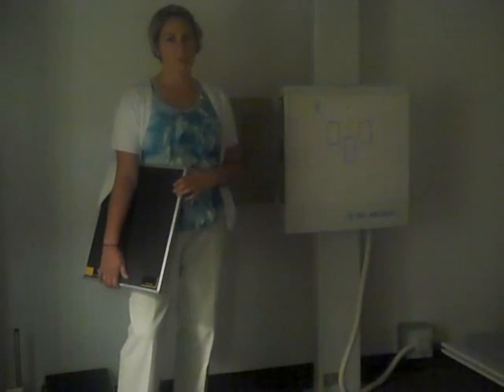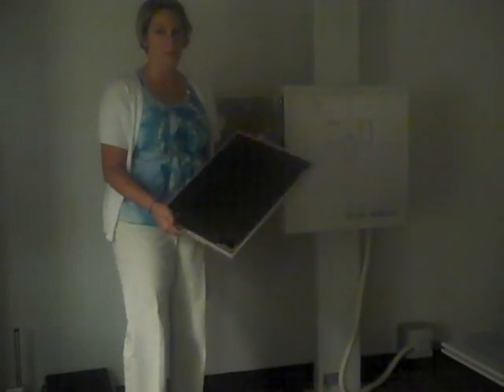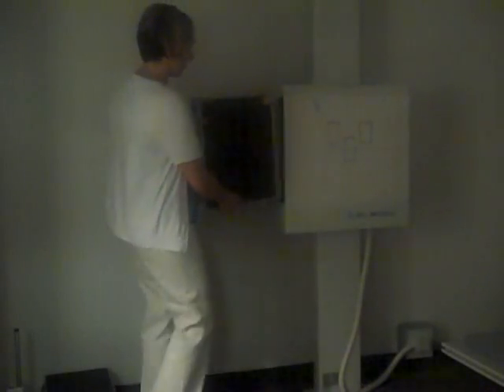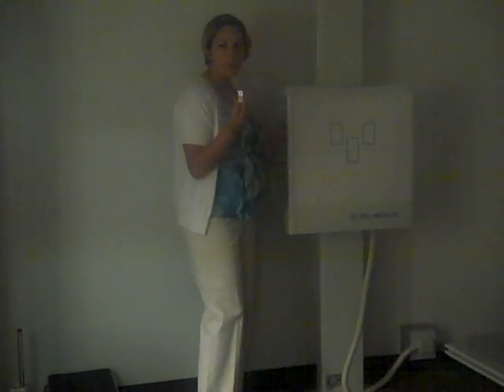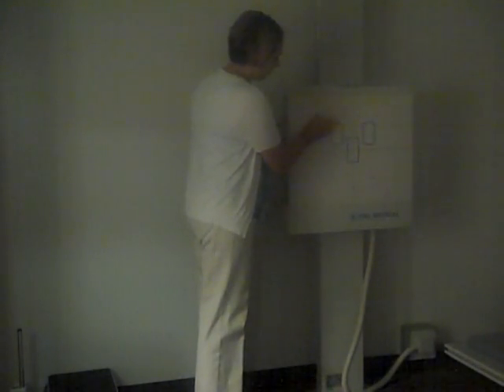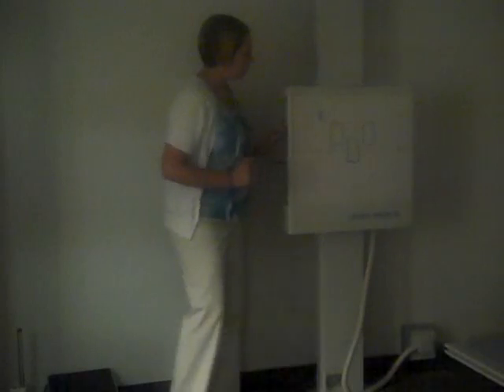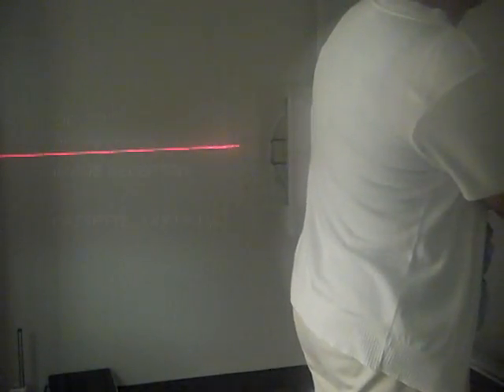The second view in the routine for the chest x-ray is the lateral. I'm going to turn my film so that it's lengthwise and put my flasher up at the top. I'm going to use my left marker because my patient's left side is going to be against the film, and I'm going to place it on the patient's back for this portion of my film. I need to realign my light field so that we're 14 x 17 lengthwise.